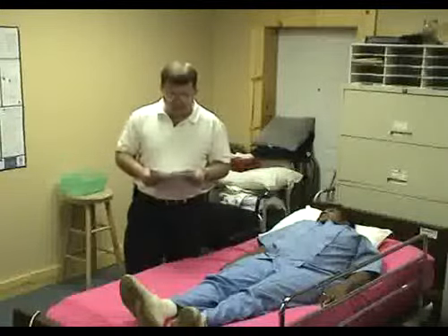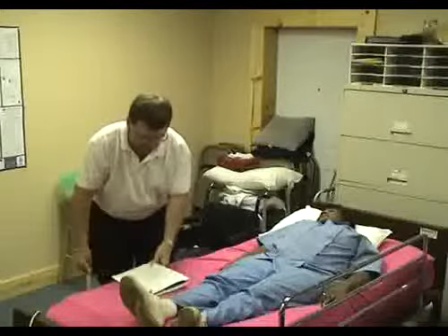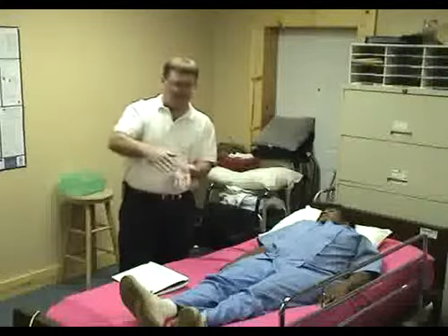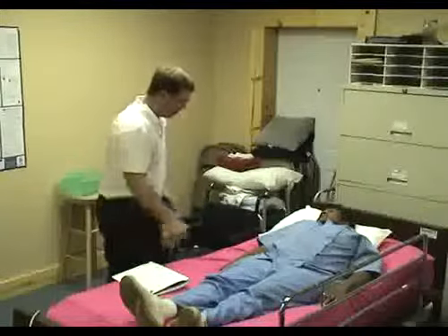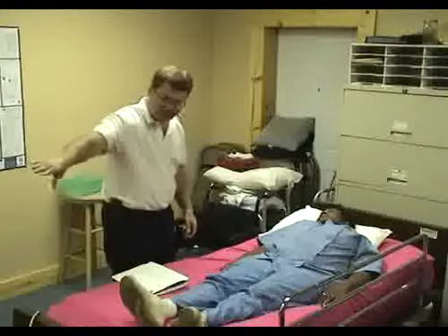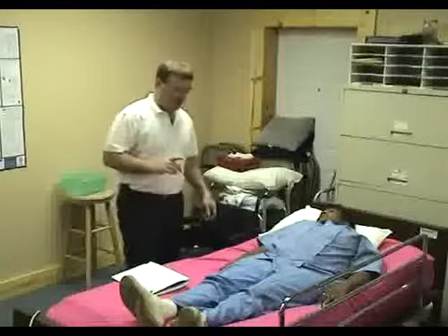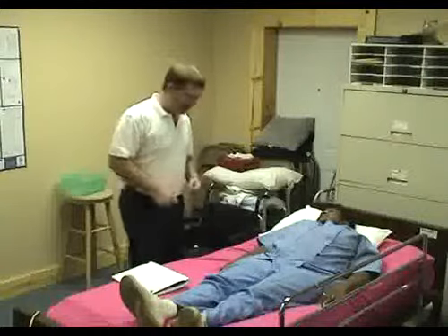Number 1, and one of the most important things, is positioning and securing the chair or wheelchair parallel to the bed. Parallel means if you had 2 straight lines, they never touch. That means they always stay the same distance apart. So if you look at the bed, it's running this way. The chair or wheelchair should also be running the same direction. What we're creating is a 90-degree angle to get a patient in and out of bed.